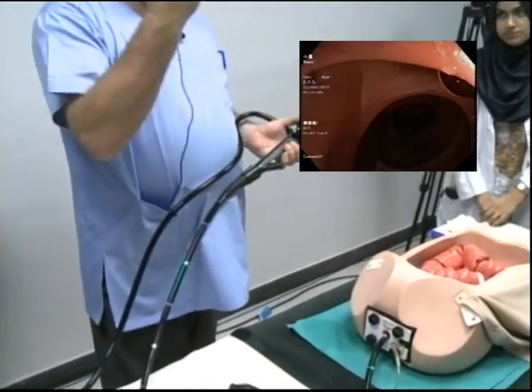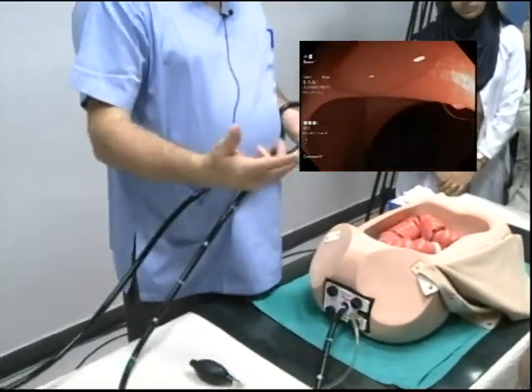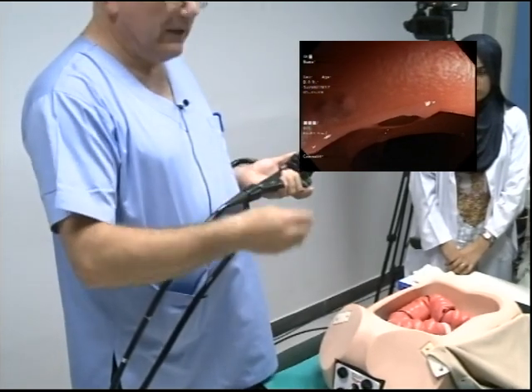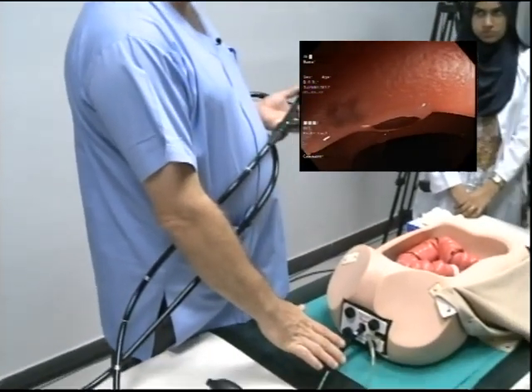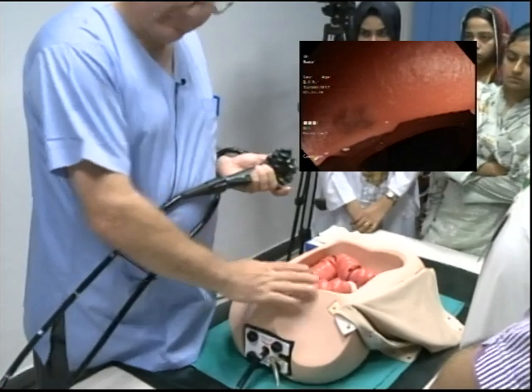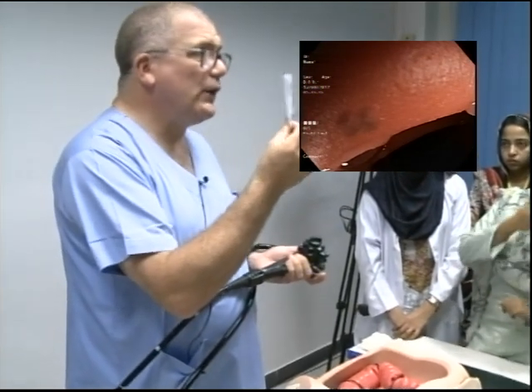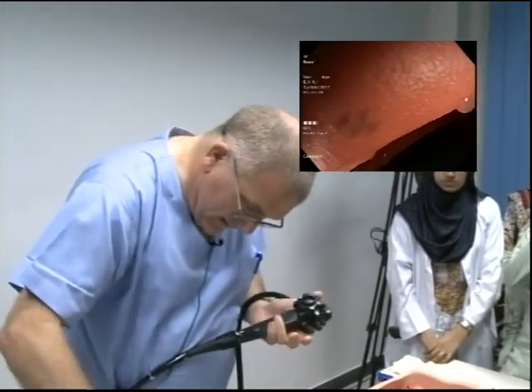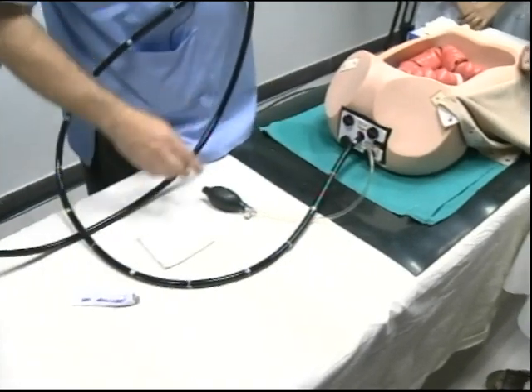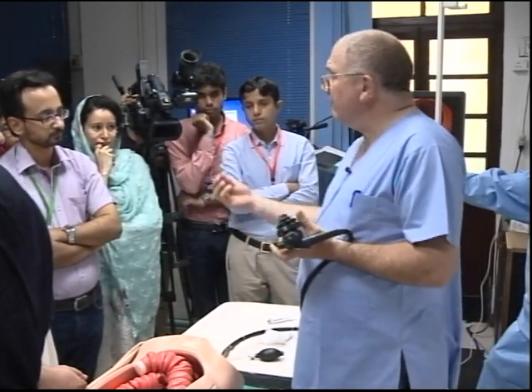I'll be asking you to put gloves on. What I wanted to do is show you that you don't need, one, this, two, I've got grease on my hand, and it's slippy. But it's better to have a slippy scope than a scope that's very dry. So if it was your bottom, how much of this do you want on it? If I was putting a scope in your bottom, do you want this amount? Or do you want lots? Lots. So what I'm saying to you is that when we're actually scoping, I don't care about that.